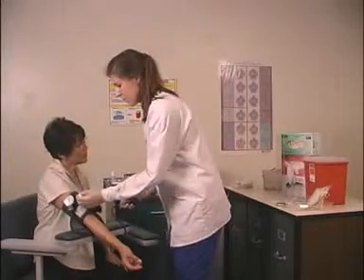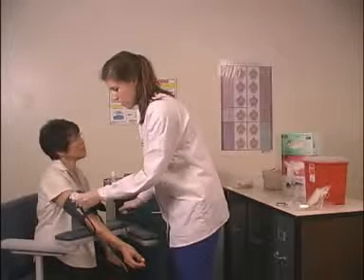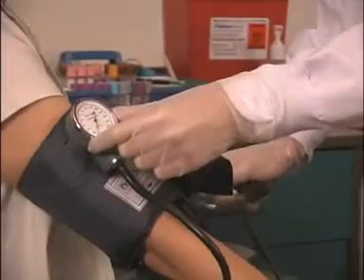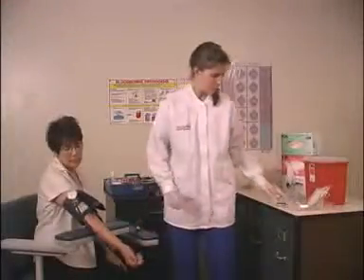Inflate the blood pressure cuff to 40 millimeters of mercury. The time between inflation of the blood pressure cuff and making the incision should be between 30 and 60 seconds. This pressure must be maintained throughout the entire procedure.